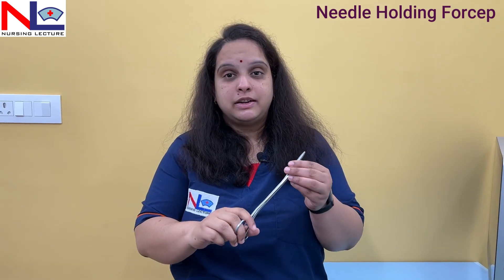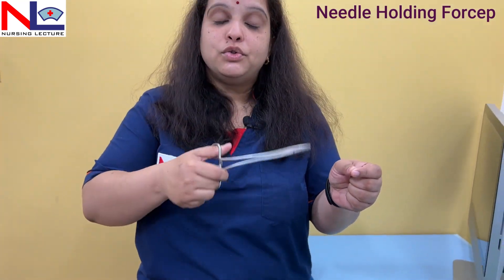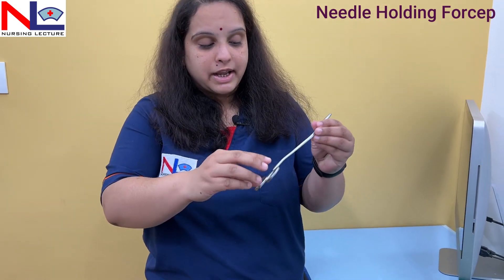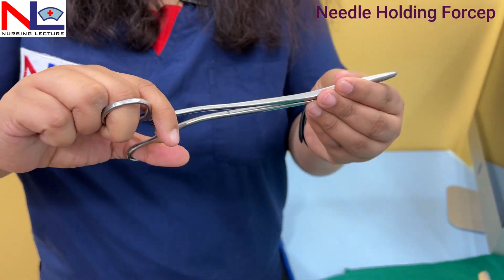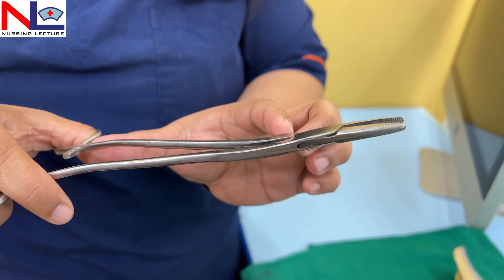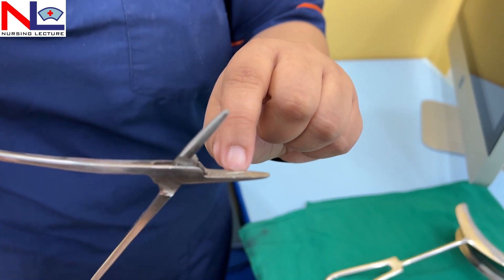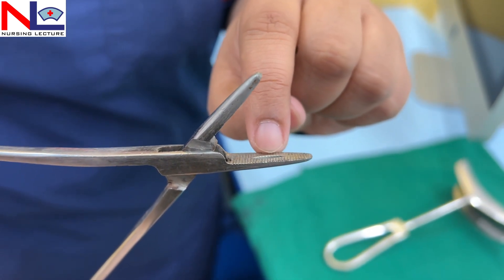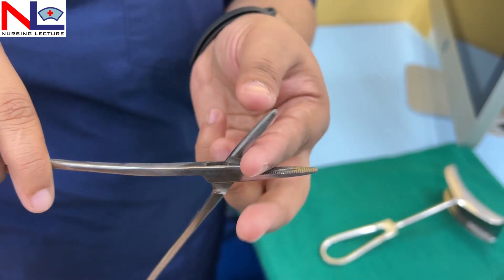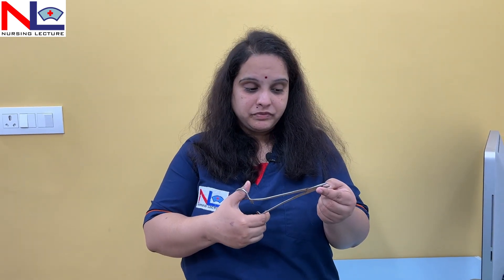The next instrument is the needle holder. As the name suggests, it mainly holds the needle, because whenever we give an incision we need to suture it up later on. To suture the incision site we require this instrument. There is a ratchet lock, and the handles are large compared to the blades, which are narrow and smaller. Both blades have serrations present, and in the middle of the blade a groove is also present. This groove holds the needle and prevents straightening of the needle. We use this instrument when doing stitching.